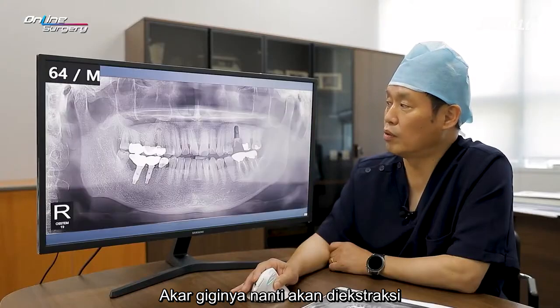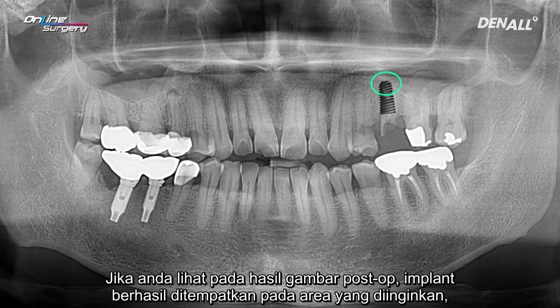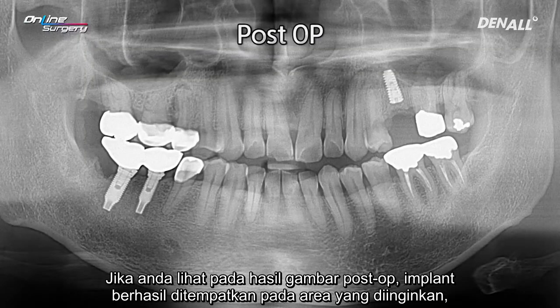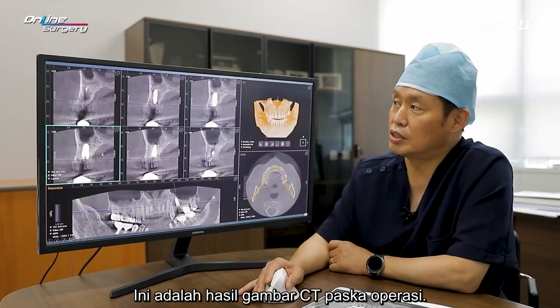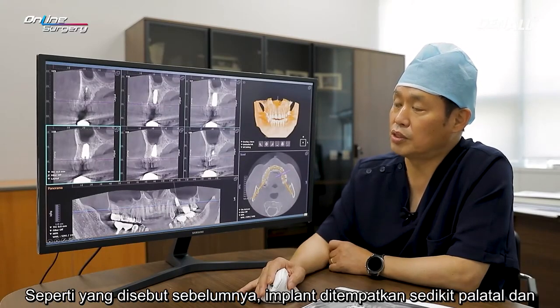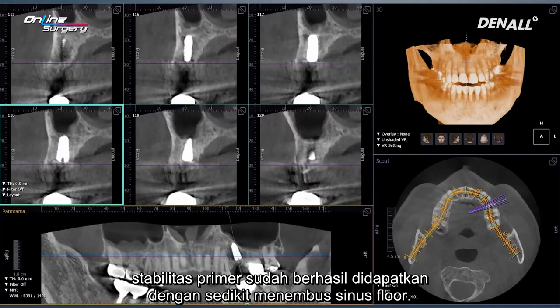The root is going to be extracted, and the implant is going to be placed like this. The sinus floor is going to be slightly, intentionally penetrated to get primary stability. If you look at the post-op image, the implant has been placed in the intended area and the sinus floor is slightly penetrated. This is the post-op CT image. As mentioned earlier, the implant itself has been placed slightly palatally and primary stability has been gained by slightly penetrating the sinus floor.